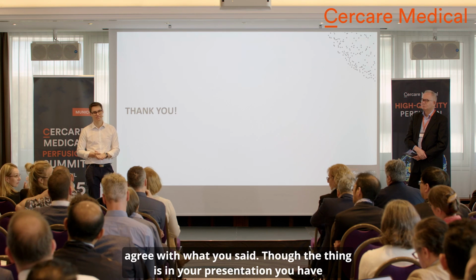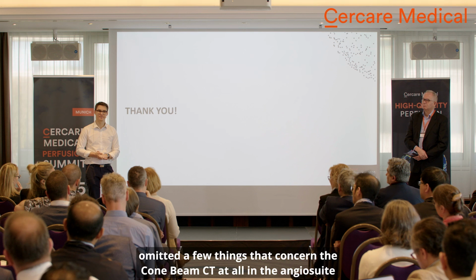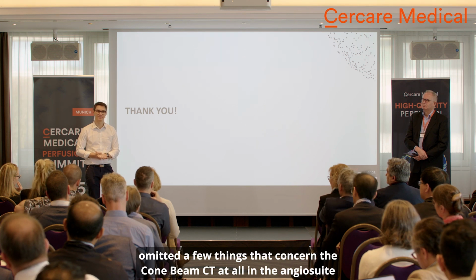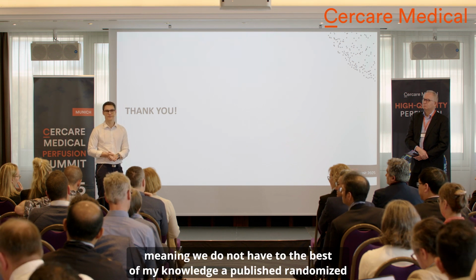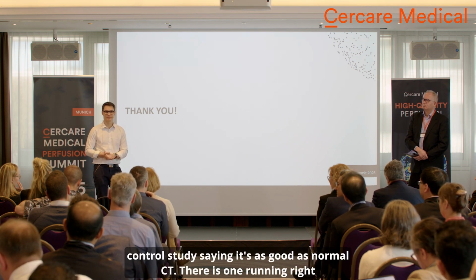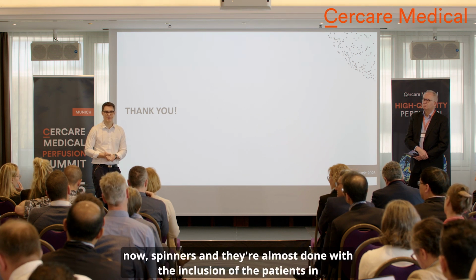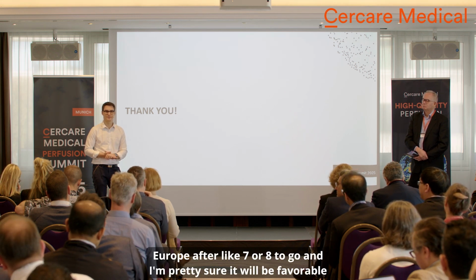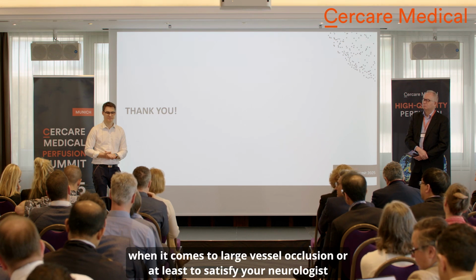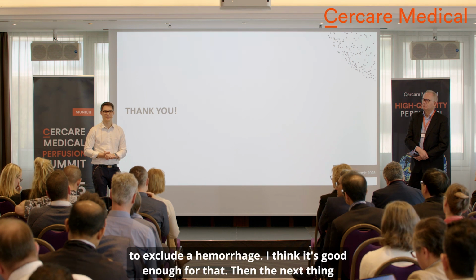So the thing is, in your presentation, you have omitted a few things that concern the cone beam CT at all in the angiosuite, meaning we do not have, to the best of my knowledge, a published randomized control study saying it's as good as a normal CT. There's one running right now, SPINNERS, and they're almost done with the inclusion of the patients in Europe, after like 7 or 8 to go. And I'm pretty sure it will be favorable when it comes to large vessel occlusion, or at least to satisfy your neurologist to exclude a hemorrhage. I think it's good enough for that.